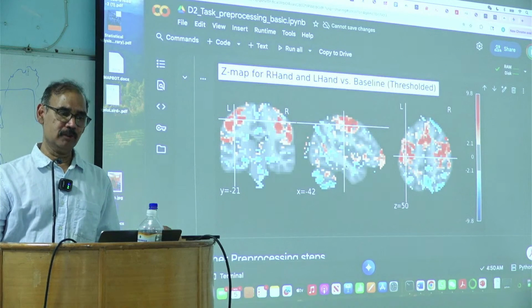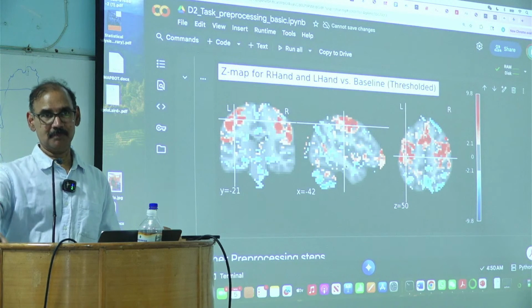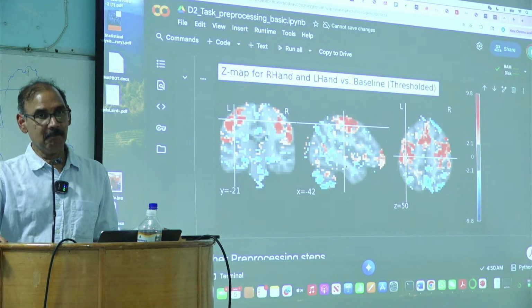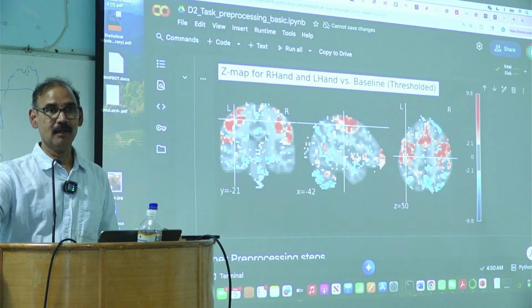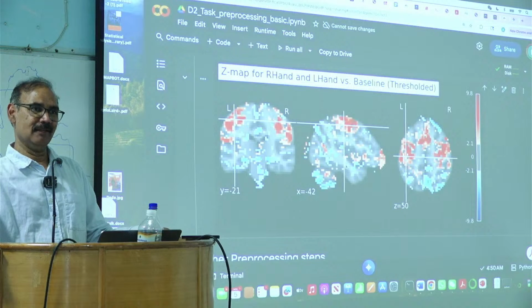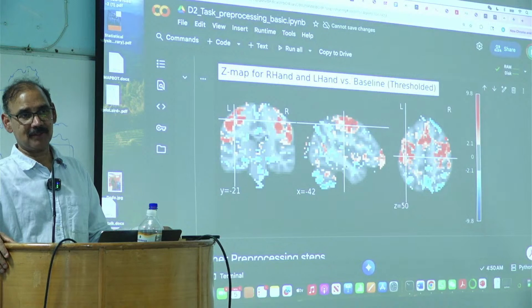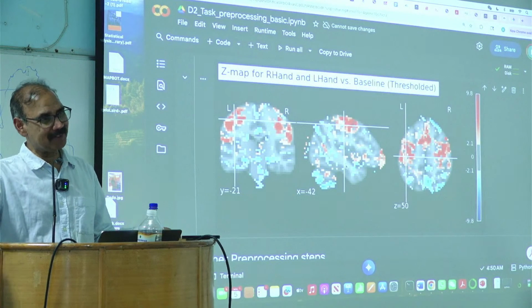Which threshold would you use? But what is optimal? How do you know it is optimal? I have told you what my research question is. I want to find which brain regions are associated with finger tapping. That's why I'm asking you, tell me the threshold.